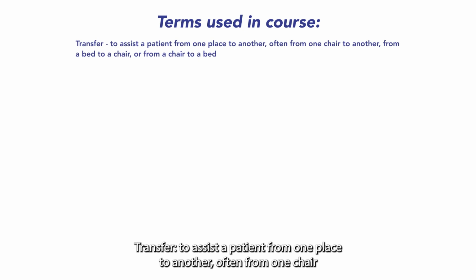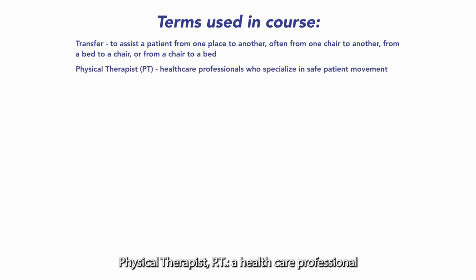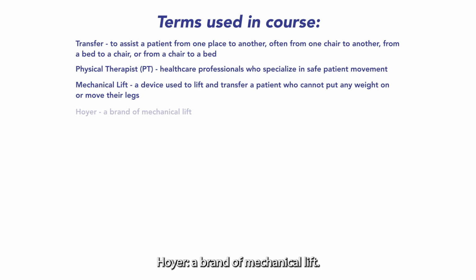Transfer. To assist a patient from one place to another, often from one chair to another, from a bed to a chair, or from a chair to a bed. Physical therapist, PT. A healthcare professional who specializes in safe patient movement. Mechanical lift, a device used to lift and transfer a patient who cannot put any weight on or move their legs. Hoyer, a brand of mechanical lift.